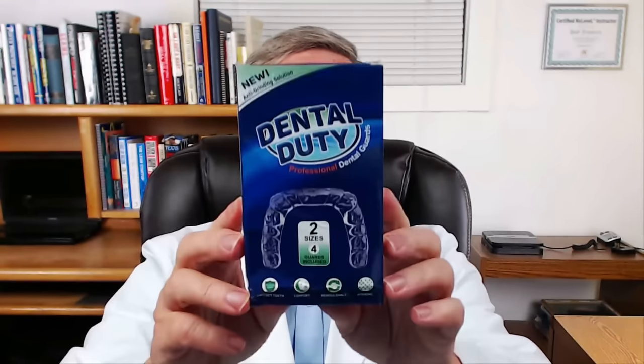Hi, this is Dr. Bob and today I'm going to do a demonstration of the Dental Duty professional dental guards. What are dental guards used for? Well, they help with grinding of the teeth, especially at nighttime. There are a couple of different ways you can do a guard: one, you can go to your dentist and pay literally hundreds of dollars for a guard, or you can do it yourself with a product like this Dental Duty.